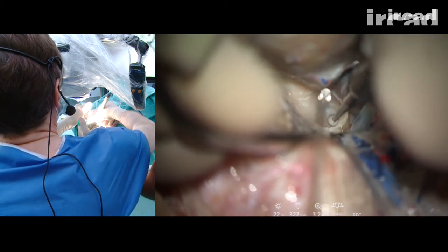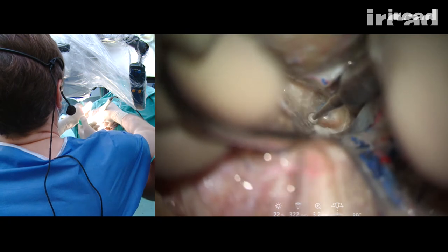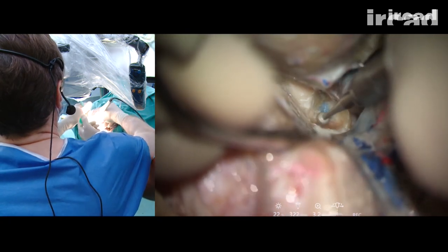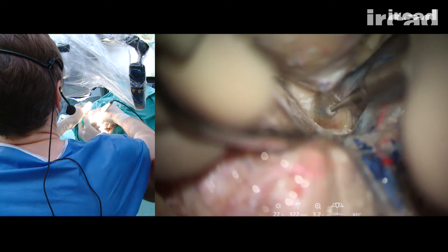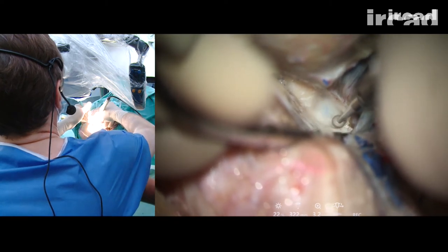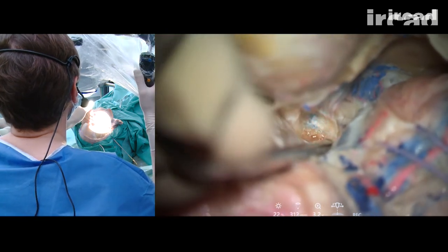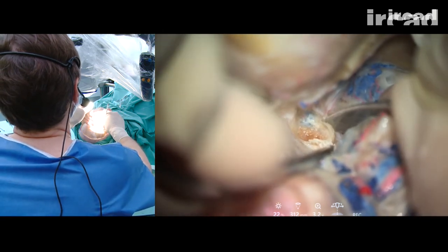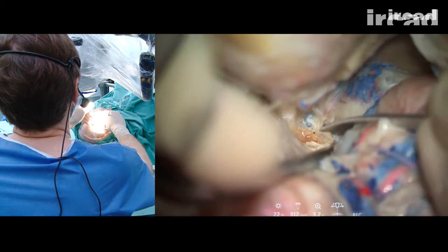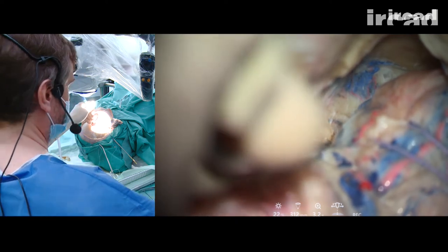So it's not always necessary to remove the tip of the clinoid. You remove it if it's in your way. If it's not, there's not necessarily a need to take it out. Okay, the tip of the clinoid is broken.